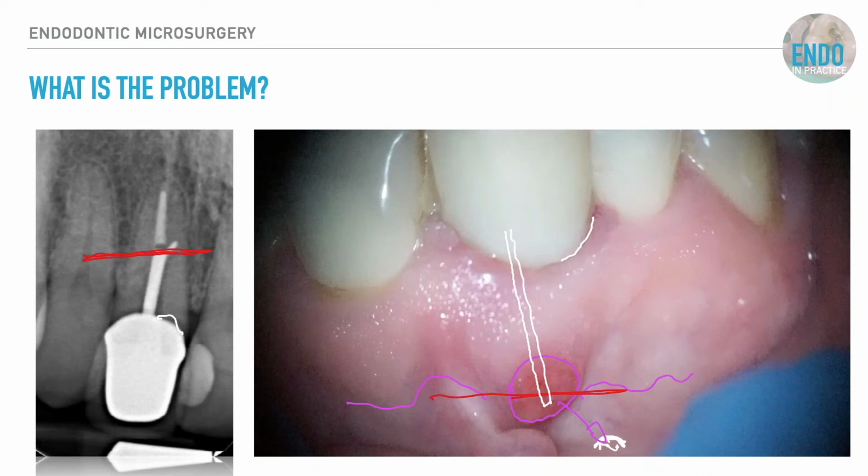So fundamentally, when I'm doing any type of endodontic assessment, in my assessment kit is a PCP12 probe for that specific reason. I'll have a BPE probe just to take a BPE for the patient, but when I'm looking at that specific tooth, it's a PCP12 probe specifically for that reason.